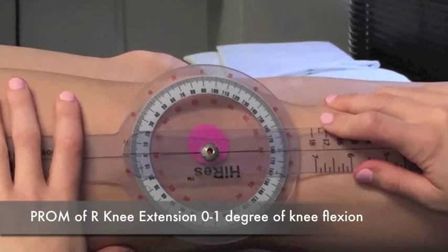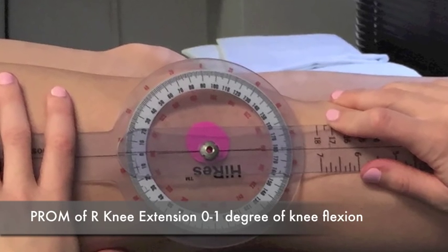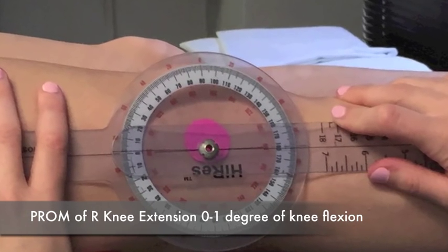Passive range of motion, right knee extension: 0 to 1 degree of knee flexion.